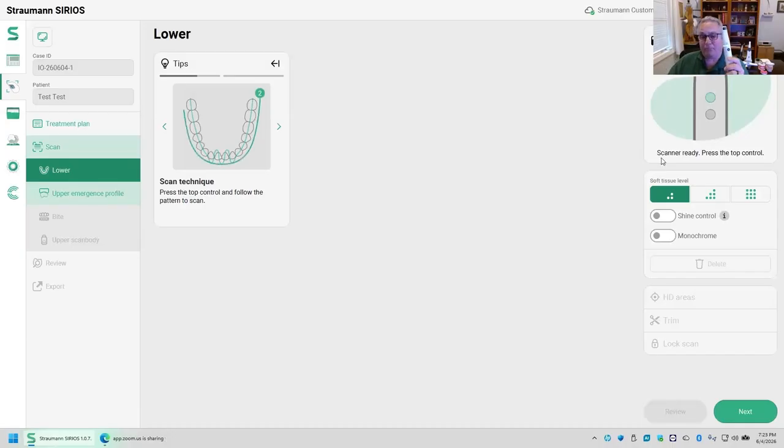I will point out right down below, so this is the scanner tile, and right below the scanner tile here is the soft tissue filter, okay? I want to mention this feature because it's relevant in many implant scanning cases. So this is the feature in the software that's going to automatically detect and eliminate lips, cheeks, and tongues. Nobody wants lips, cheeks, and tongues in their scans, right? But this filter does much more than that.